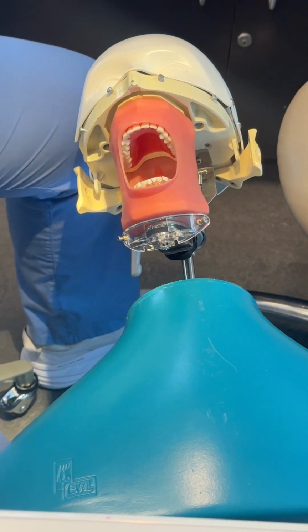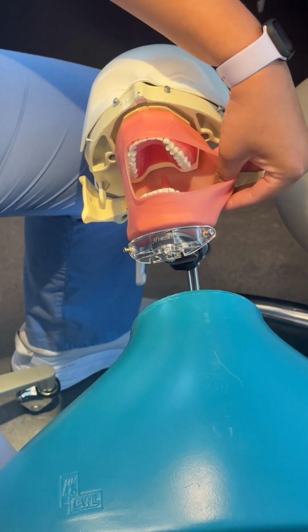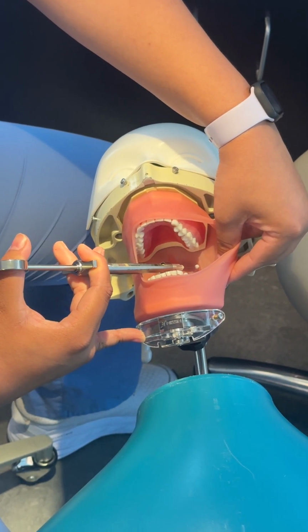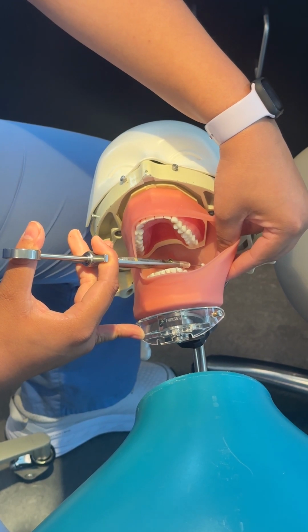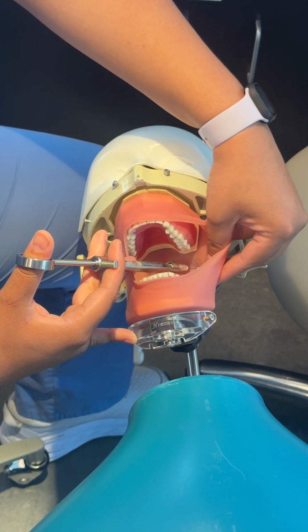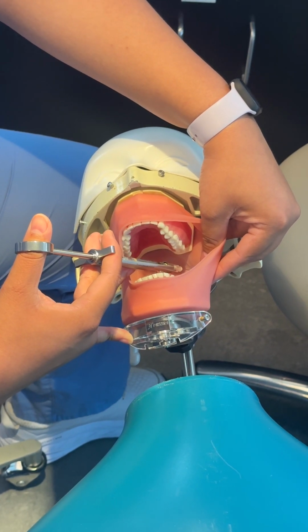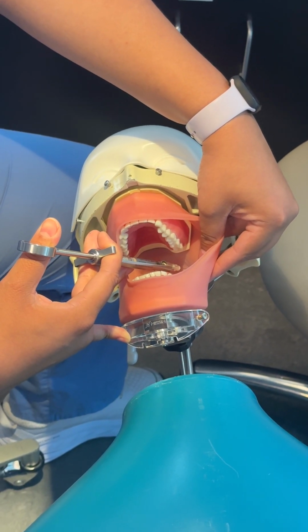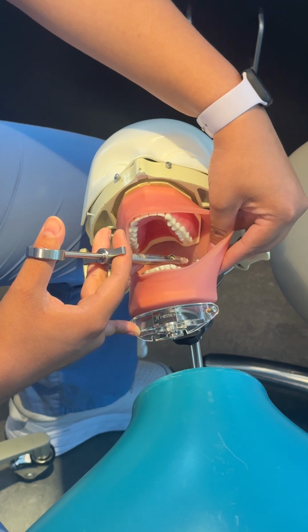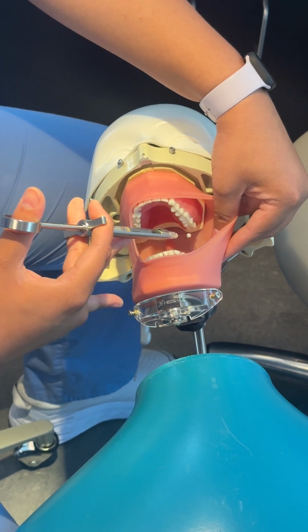So right now I'm going to start the IA lingual. Gonna retract, use my finger, just gonna go in, contralateral, the 2 premolars. So I'm gonna insert 20 to 25, and aspiration, tap osseous, target reached, aspiration negative, quarter turn, aspiration negative, depositing. Okay, and then I'll retract 10 millimeters for the lingual. I'll go ahead and do aspiration negative, and okay, and then withdraw.